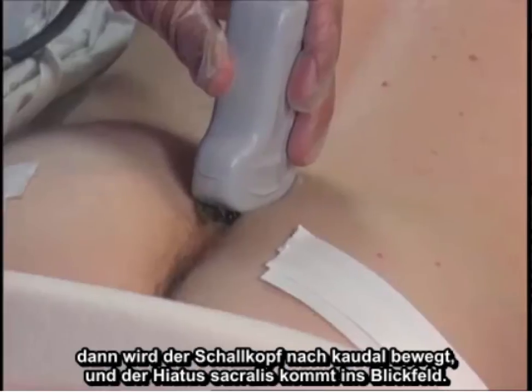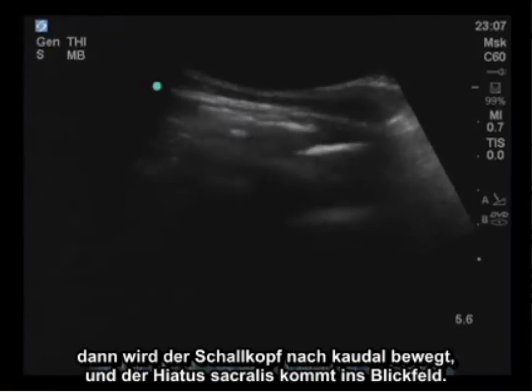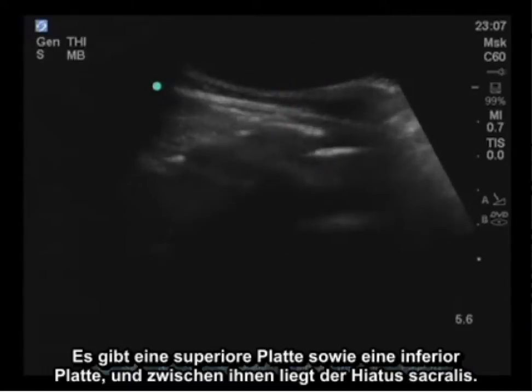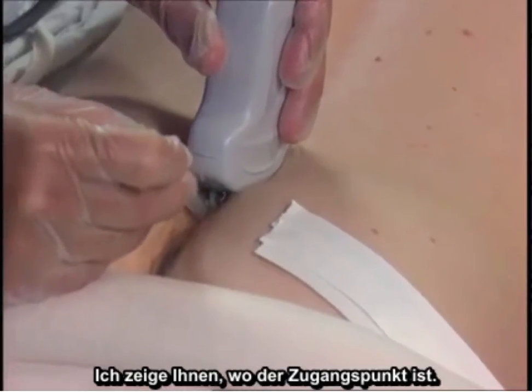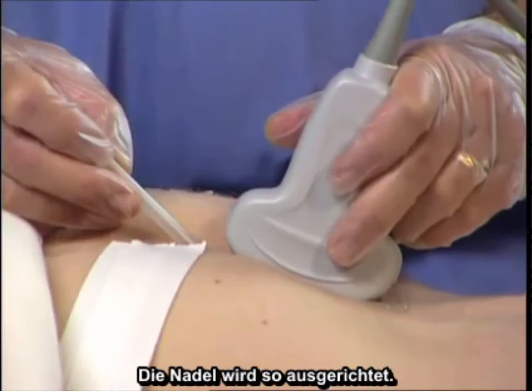And then the probe is moved caudally, and very clearly the sacral hiatus comes into view. There is a superior plate and an inferior plate, and in between them is the sacral hiatus. I'll demonstrate where that access point is. The needle is angled thusly.